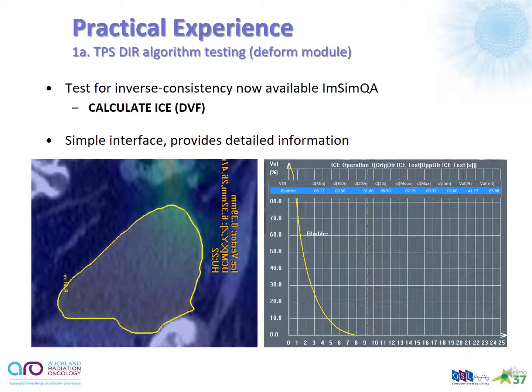So this process can be sped up significantly using the tools available within the deform module in ImSimQA. This system now allows us to import the DVFs from RayStation in both the forward and inverse direction, and to perform some batch processing where the so-called ICE is calculated.